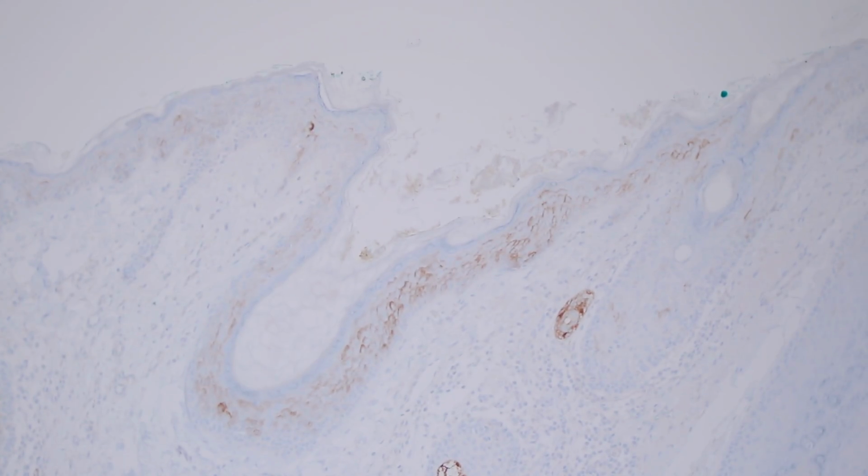So the EMA staining there in the sebaceous gland, that's one thing. You can look, the epidermis is mostly negative for EMA, although you can see over here, sometimes you can have some weak, patchy expression of EMA in the epidermis. And I think that's important to keep in mind because EMA is often used as a marker to look for some sweat gland tumors, and we'll show you why in a minute, but it can occasionally stain. I mean, a fair subset actually of squamous cell carcinomas will pick up some EMA.